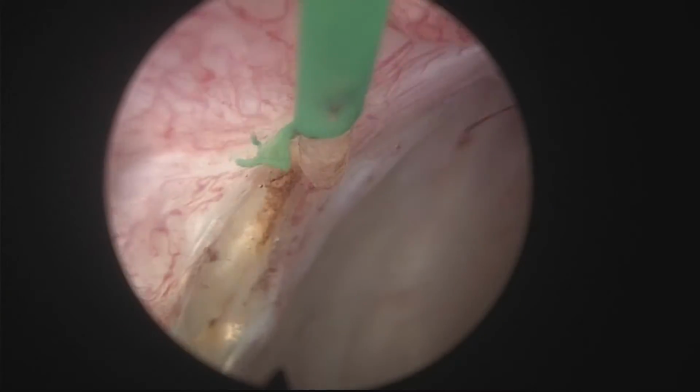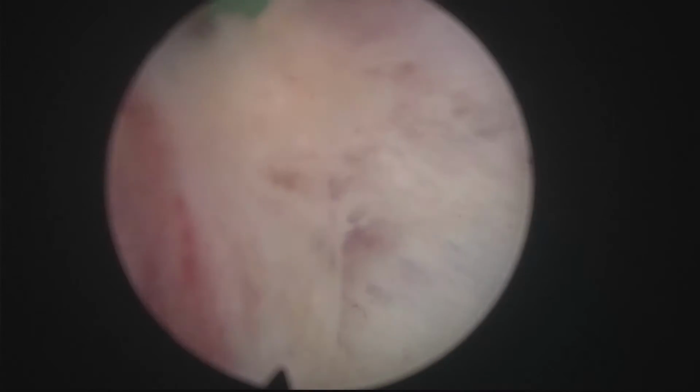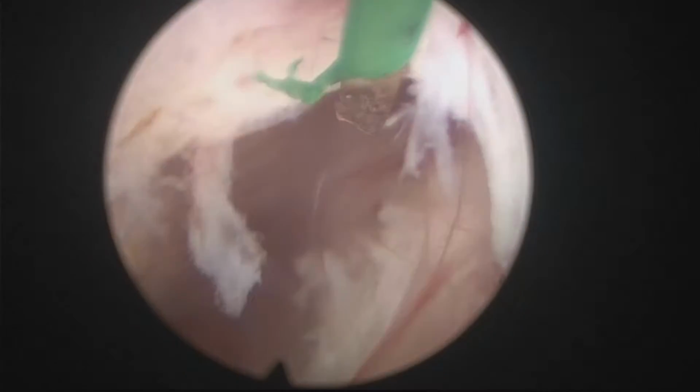Here, in some areas there's going to be less remaining tissue. It's going to be a thinner slice of remaining BPH tissue, or maybe in some areas you could be at the level of the interface between the capsule and the adenoma. So that's what makes these redo cases a little bit more challenging and more interesting.